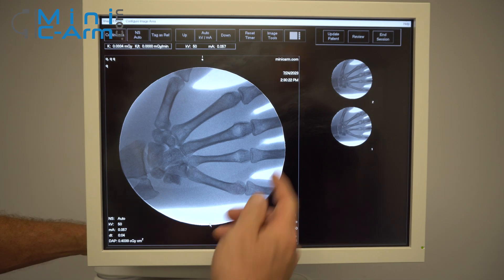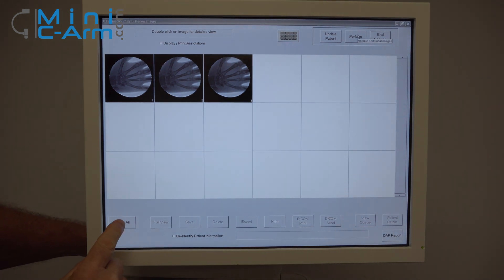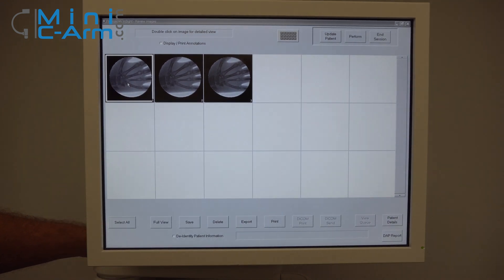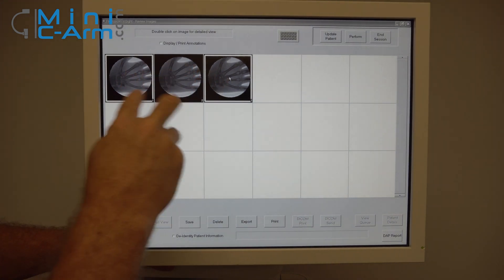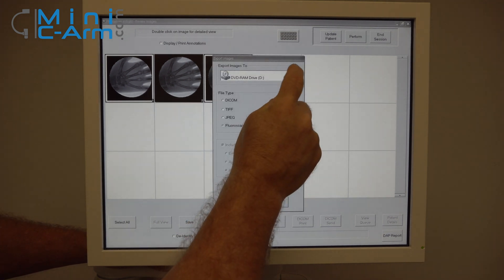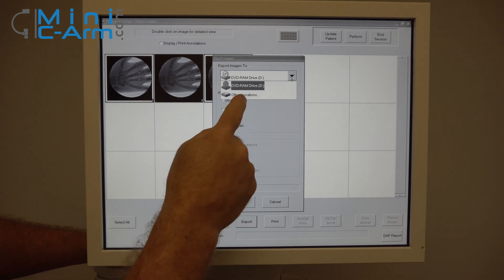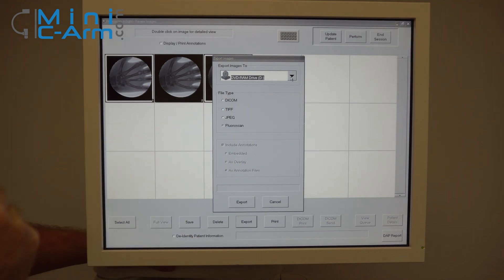Once you're finished imaging, press the Review button. Here's your review screen. You can either select all or select specific images that you want — hold the control button down and tap the images to select specific ones. You can either print them or export them. If there was a USB stick loaded, you'd be able to see it here, and then you could send your images as a DICOM, TIFF, or JPEG.